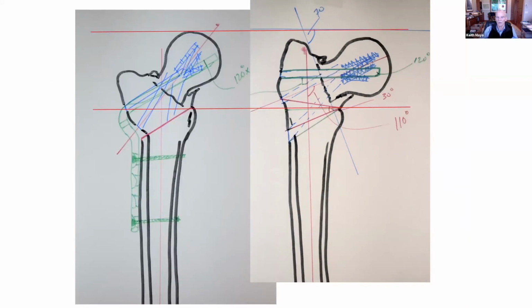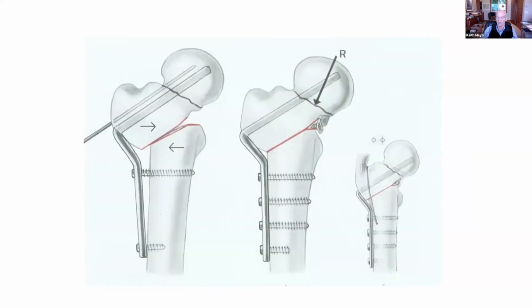And then you'll have a composite which has the implant in place and the original deformity drawing, and you should be able to take your composite. And the way to get compression is by mismatch. Okay, so hopefully most of you are used to using the articulated tensioning device to tension low angled blade plates.